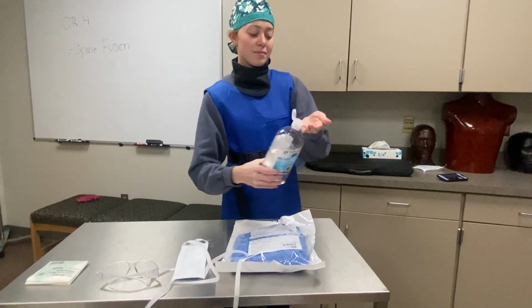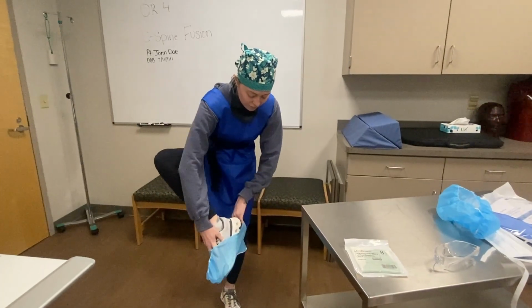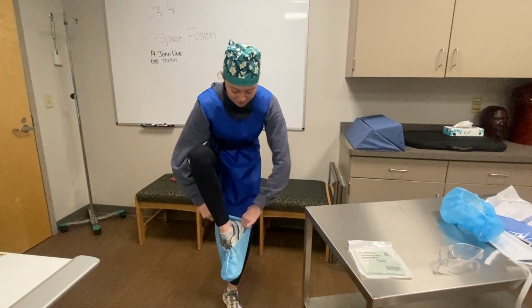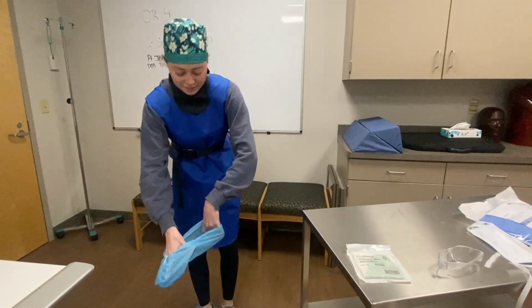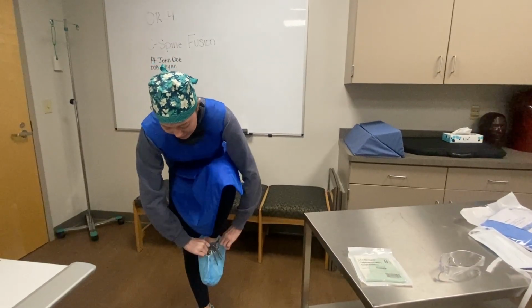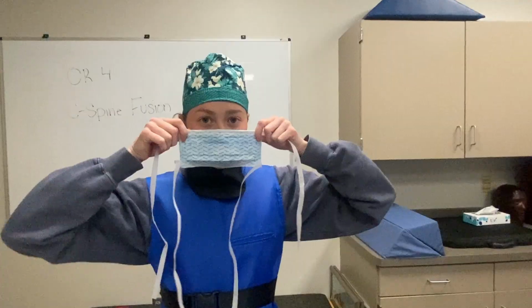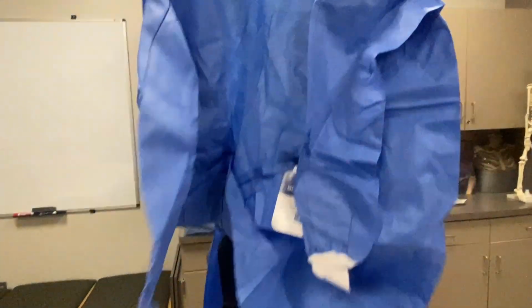Before walking into a sterile environment, make sure you have hospital-issued scrubs, booties over your shoes, a hairnet or scrub cap, and a mask on whenever walking around in a sterile corridor. As X-ray techs, we need to put on our lead aprons, a thyroid collar, and to make sure our dosimeters are placed outside of our lead around the thyroid region before starting the sterile PPE process.